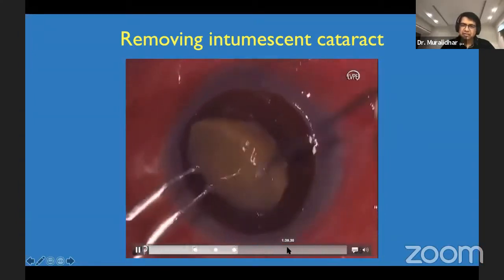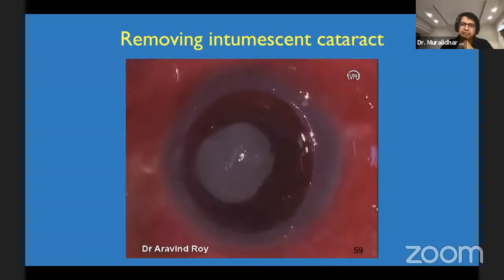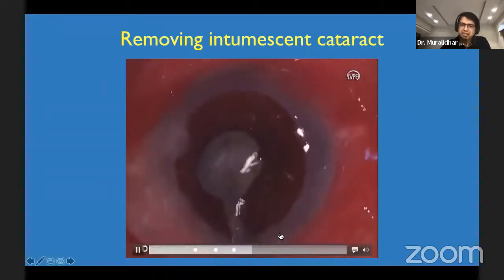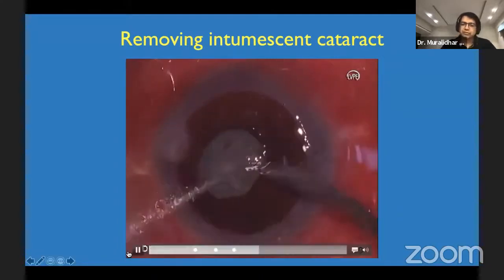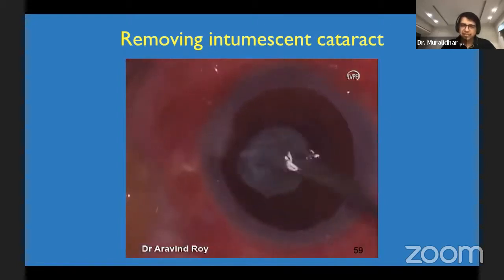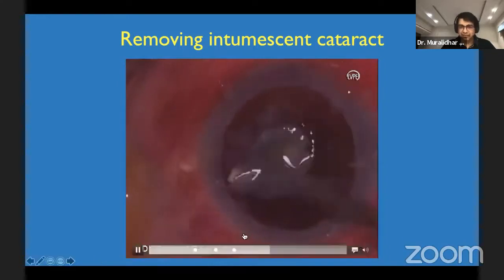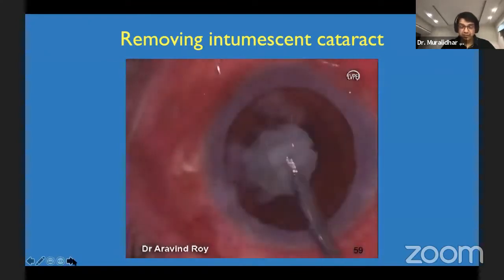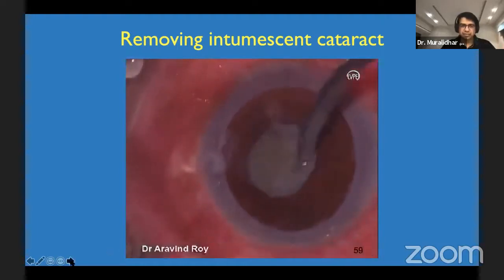And the surgeon is removing here one of the mature cataracts. Even if we have to remove the cataract, never attempt an intraocular lens when you suspect that your etiology is infective. You can also do an indirect ophthalmoscopic examination at the end of surgery. If you find the glow is unhealthy, or you suspect posterior segment issues, it can be co-managed at the same time rather than postponing to the next day. So that does really influence the post-operative outcome.